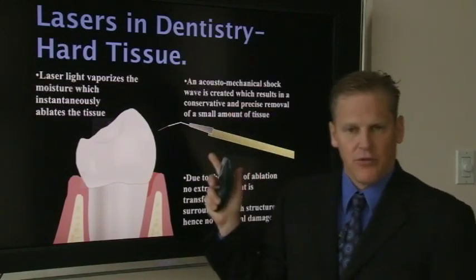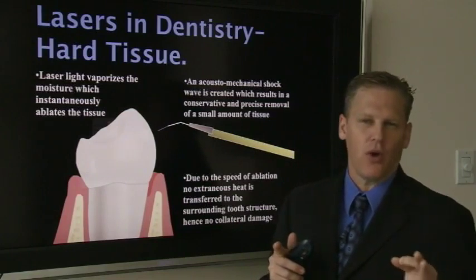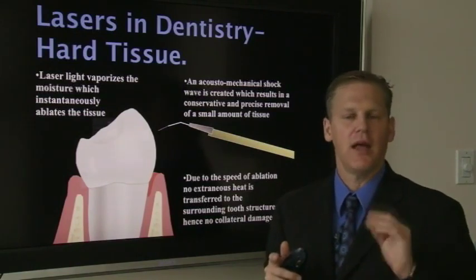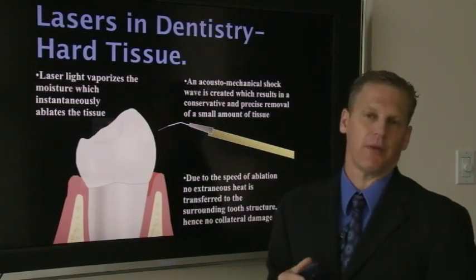When the hard tissue laser is working, you will find there is what we call an acoustic mechanical noise, and it's actually a popping noise that you will hear, pop, pop, pop, pop, pop, with the hard tissue lasers. With the soft tissue lasers, you don't necessarily hear that, but you hear that with the hard tissue lasers, and you will observe that that is in conjunction with the pulse rate.